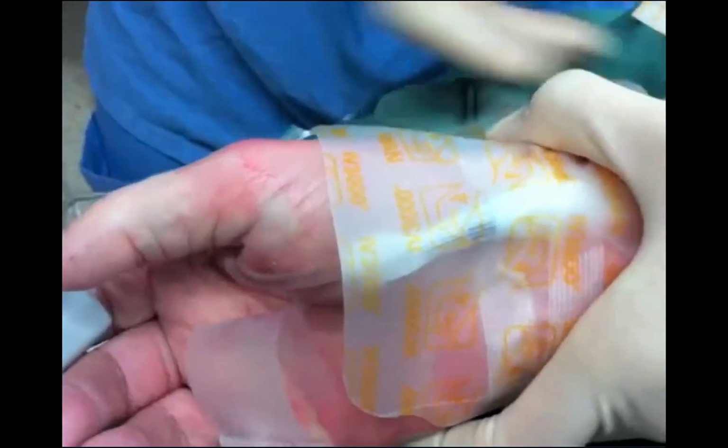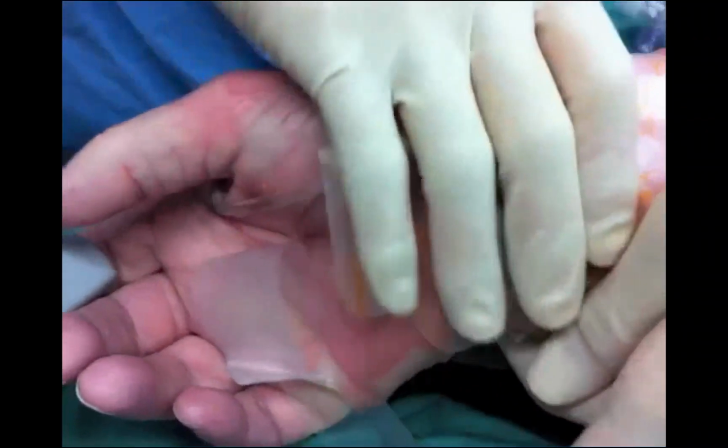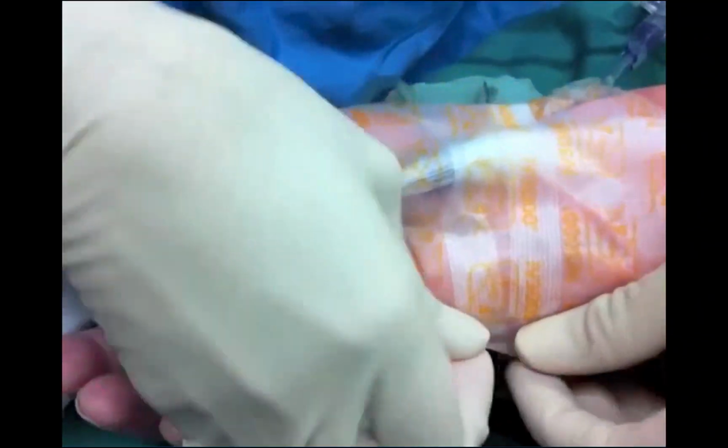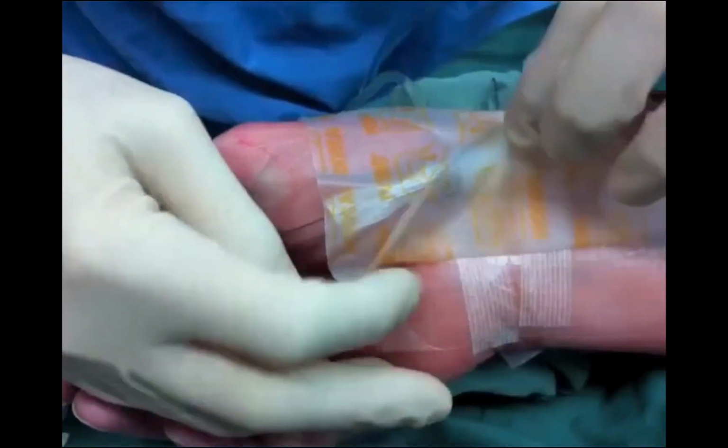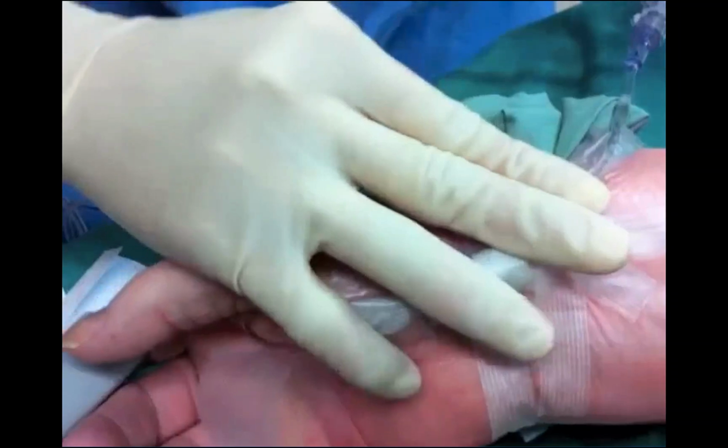Line sepsis is a rare but serious complication. The first indication of line sepsis may be the development of redness at the site of insertion. The diagnosis of line sepsis may be delayed if the point of insertion is obscured by the dressing.